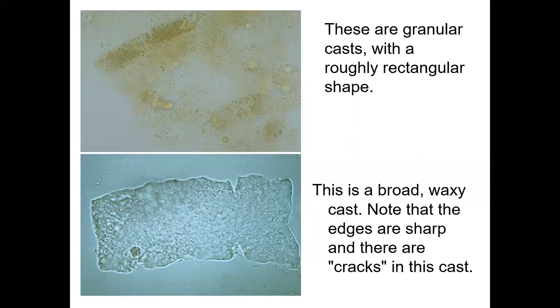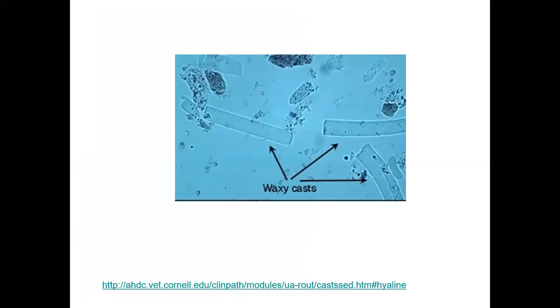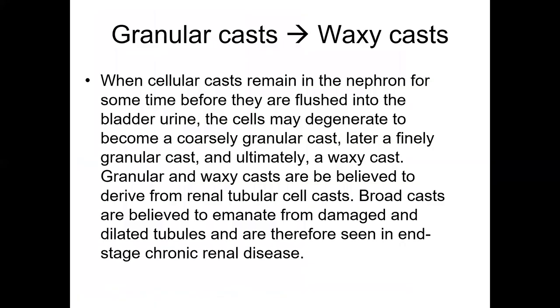This is a waxy cast — a very old, granular cast. Dehydration and changes in pH can cause this kind of appearance. This is a broad waxy cast, and you can really see it here. This is actual urine microscopy showing casts. The static PowerPoint has more background information on these.